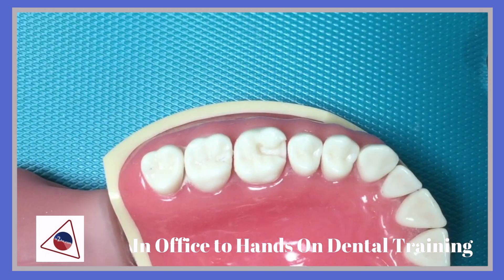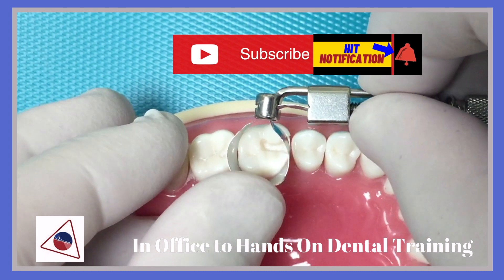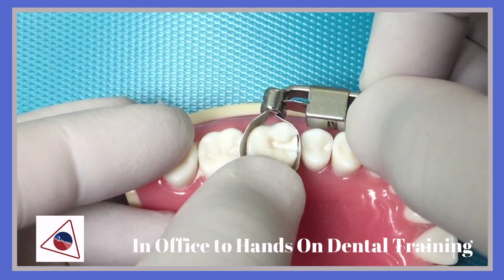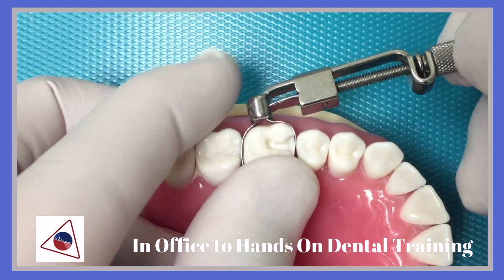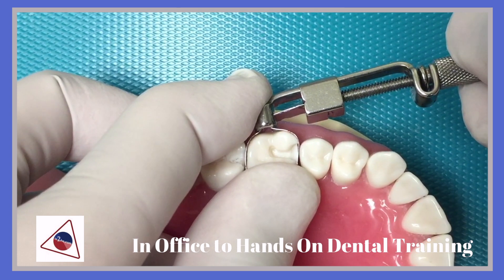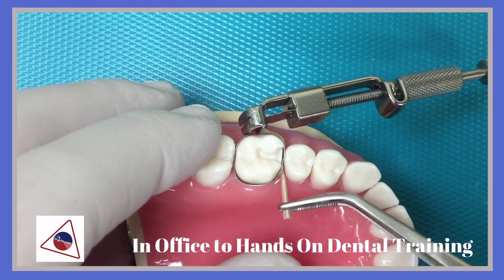Now, after the amalgam preparation, you are ready to restore the amalgam prep. A very critical step would be the adaptation of the matrix band. This will help in the contour of the embrasure, the proximal contact to the next tooth, and being able to contour the occlusion at the marginal ridge area.